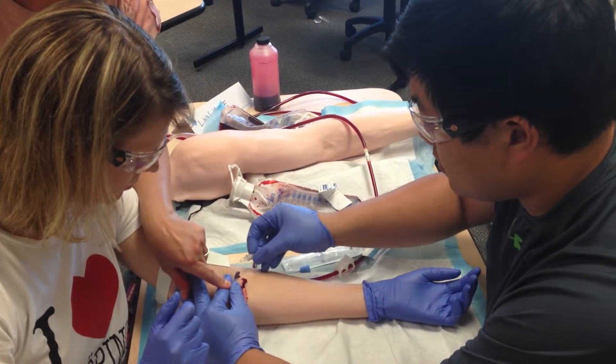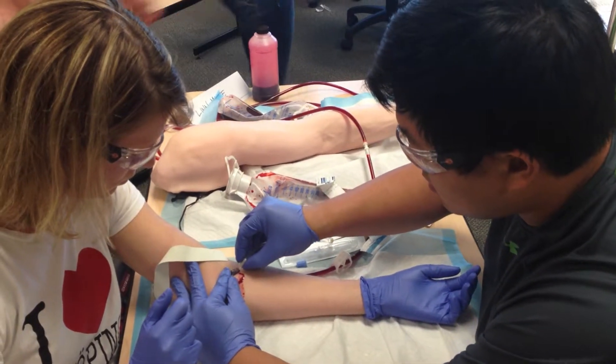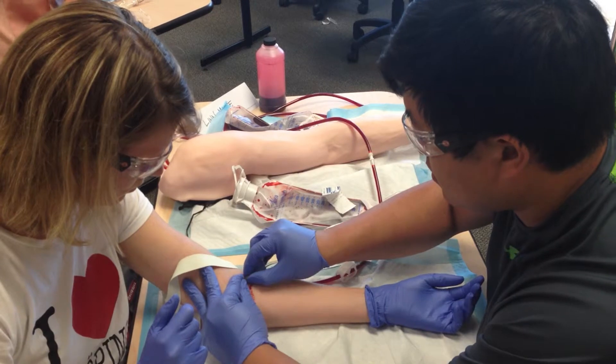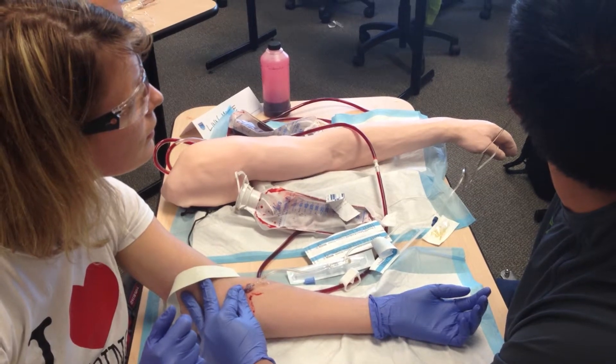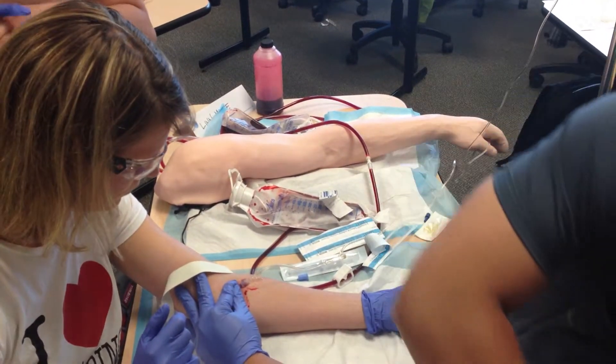Roll your finger that way and occlude higher. You'll see how it's occluding better? Because you've got to think your catheter is about an inch long — you've got to occlude on top of the catheter, not on the catheter. So if you think here, you've got to go up here. Occlude the vessel, not the catheter. That's probably why we're doing it. Makes sense. It's good to know.